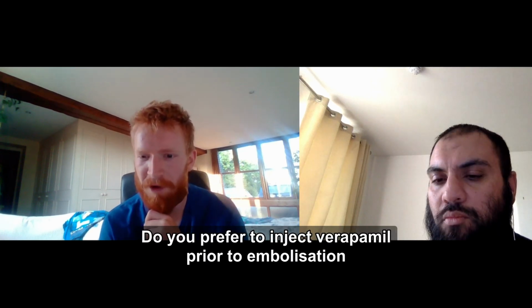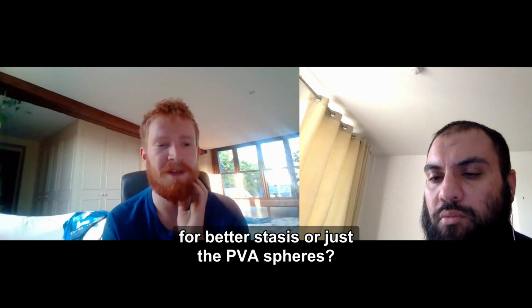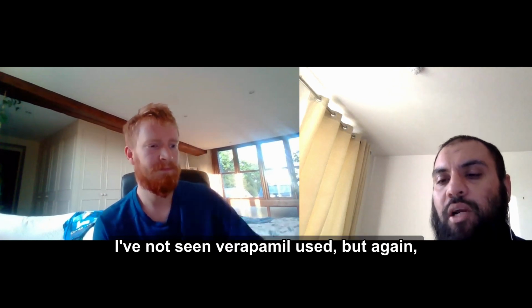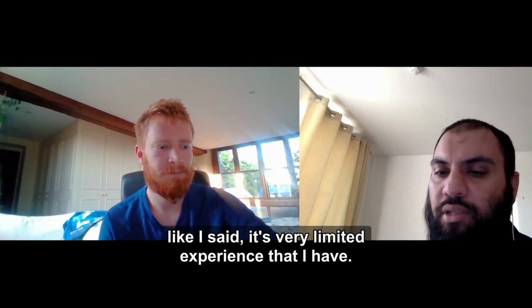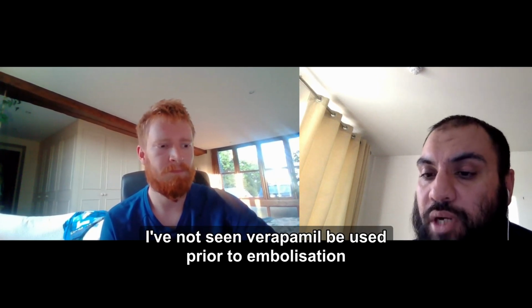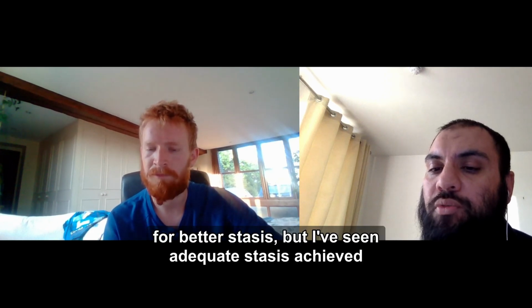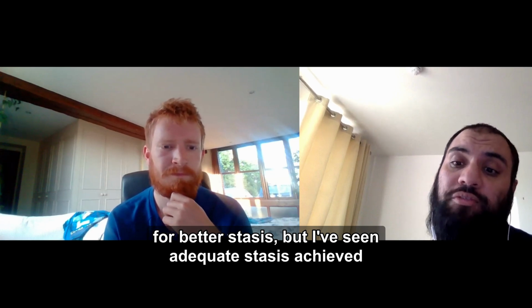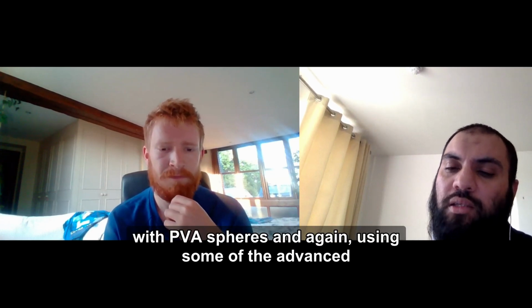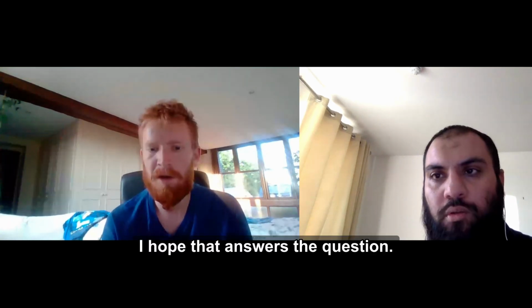Do you prefer to inject verapamil prior to embolization for better stasis, or just the PVA spheres? I've not seen verapamil used, but again, like I said, it's very limited experience that I have. I've not seen verapamil used prior to embolization for better stasis, but I've seen adequate stasis achieved with PVA spheres, and again using some of the advanced techniques, particularly with regards to perfected, to get a good amount of stasis. I hope that answers the question.